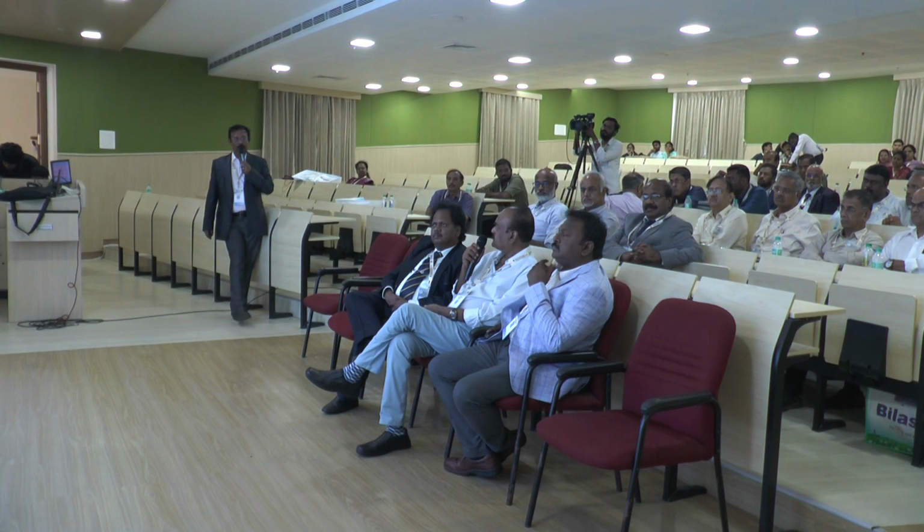External auditory canal. Does the external auditory canal anatomy bother you in endoscopic ear surgery? Professor Sundarakishan? Not necessarily, because that is one of the main advantages of endoscopy. Because of the panoramic view given by the endoscope, you can see beyond the canal. Sometimes the canal has to be there. If you use a microscope, the canal has to be addressed. Exactly. You can bypass it and you have a good view of the planning.